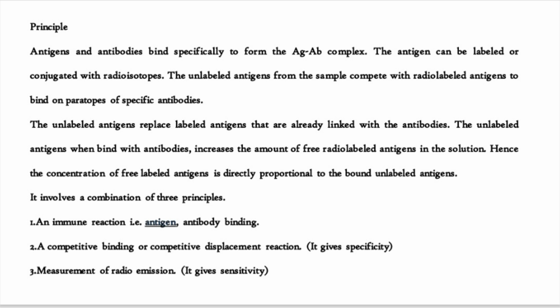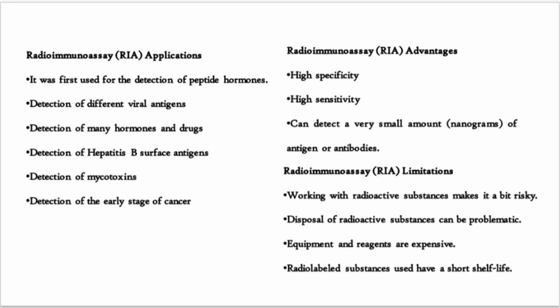It involves a combination of three principles. 1. An immune reaction, that is antigen-antibody binding. 2. A competitive binding or competitive displacement reaction, which gives specificity. 3. Measurement of radio emission, which gives sensitivity.